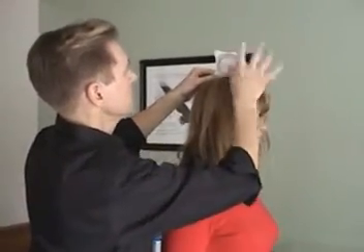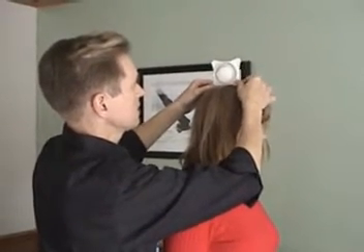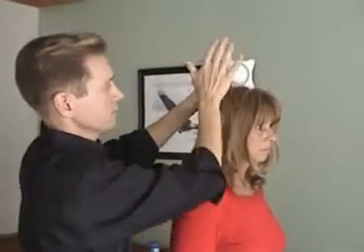If the needle is leaned one way or the other, it will tend to stick just a little bit. So make sure you get it at a neutral point and have it straight vertical.